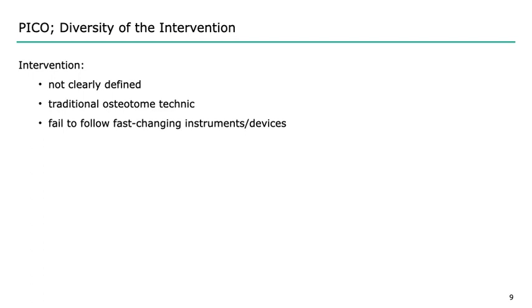Looking at some literature about the transcrestal approach, some papers didn't give detail on the surgical method that they used, and the traditional Summers technique, which is not used anymore, was used in some papers, must be old papers. But nowadays, there are so many different methods to elevate the sinus floor, and we see many innovative surgical instruments for this method. So actually, nobody does sinus floor elevation the way Summers did. So the Summers osteotome technique is no longer available.